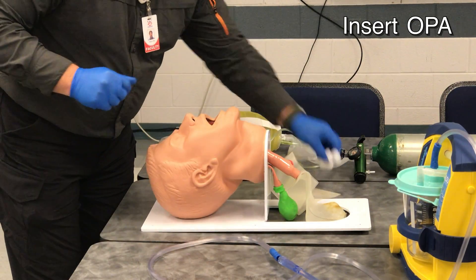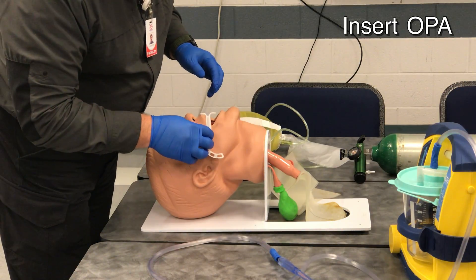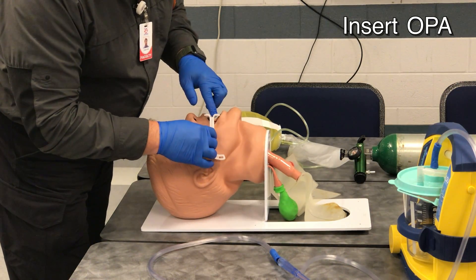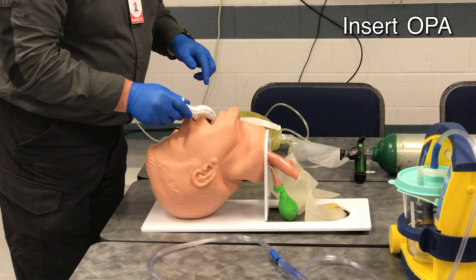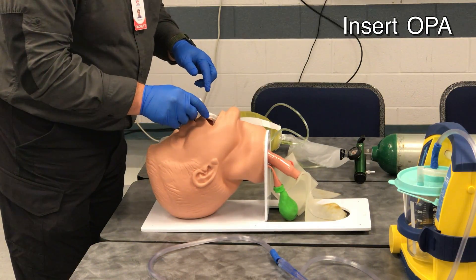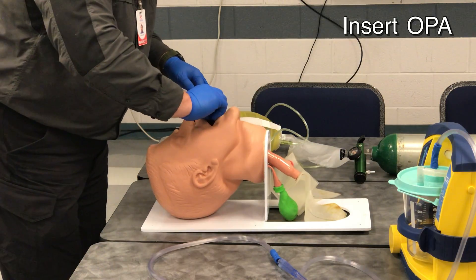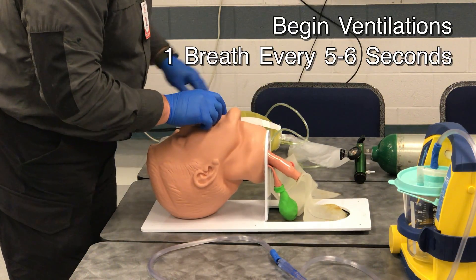At this time, I will take the appropriate sized OPA going from the angle of the jaw to the corner of the mouth. Insert it 90 degrees to 180 degrees upside down. Get past the tongue and insert it and let it rest at the lips.